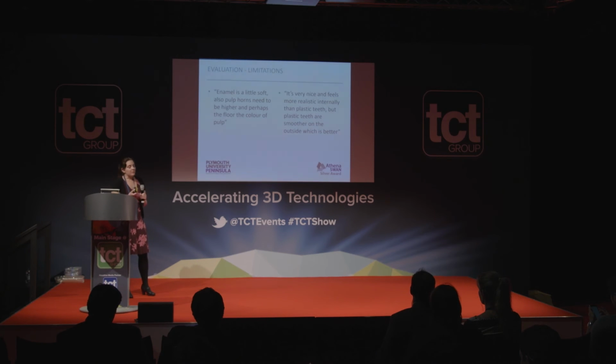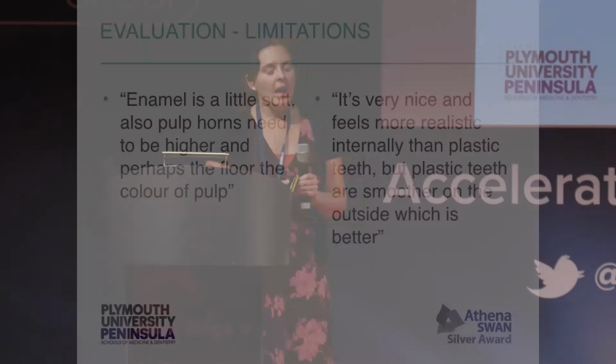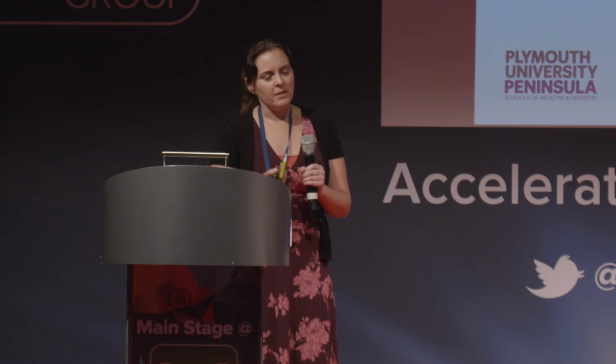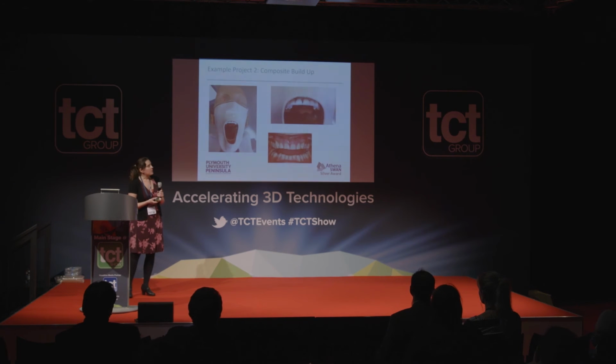The students did like it, but one of them did comment that the original plastic teeth that we're using did have a smoother surface, and obviously real teeth have quite a smooth surface. And I think it's just the nature of 3D printing, because things are laid down in layers or in little dots, that you are always going to have that layered effect to some extent. However, again, I think overall the finish was pretty good, and it does look really good. I think the benefits are still outweighing the cons. So that was our main project.